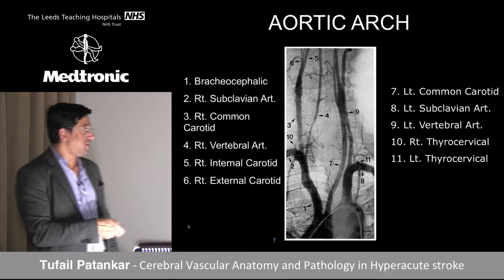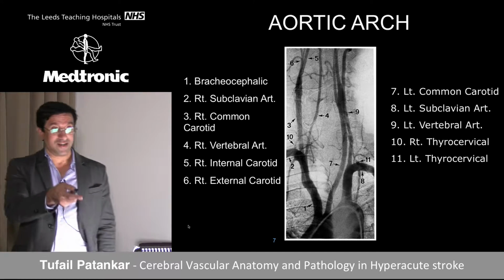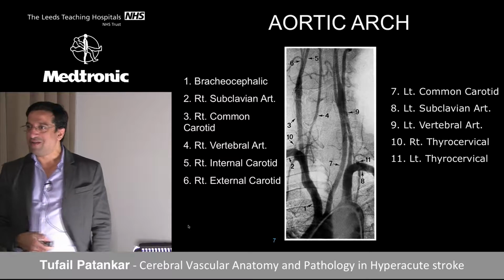If you've got an internal mammary, I remember when I was a trainee, I missed an internal mammary artery aneurysm. And Ravi was next day, and Venkat was my colleague at the time. I told my consultant it's all normal, because obviously I missed the internal mammary artery aneurysm.